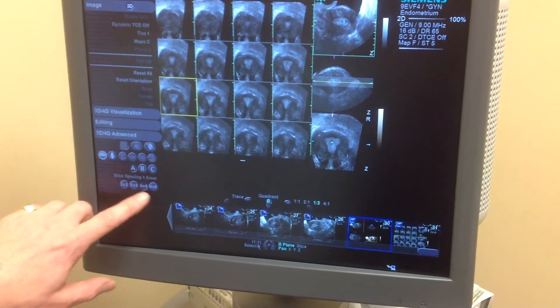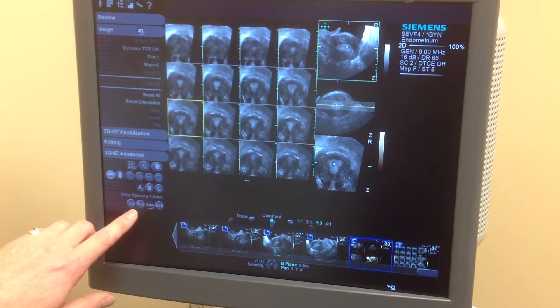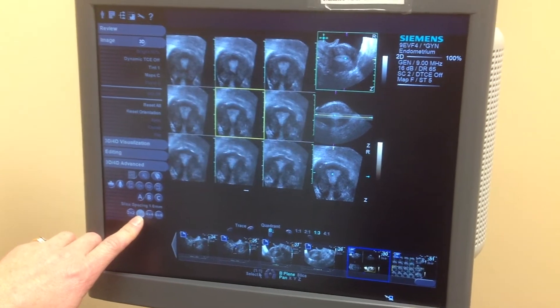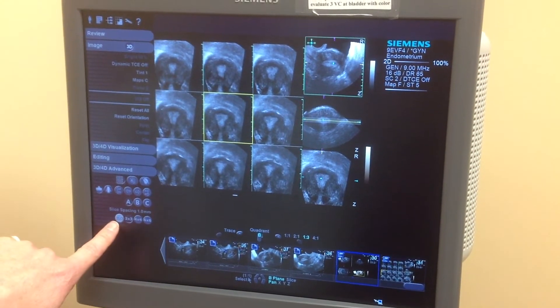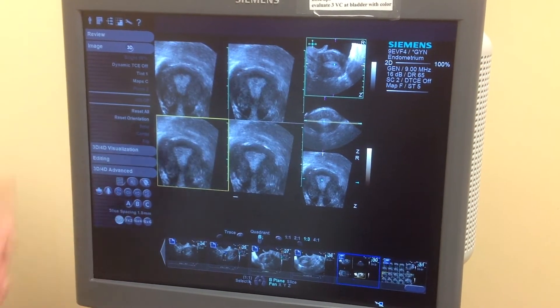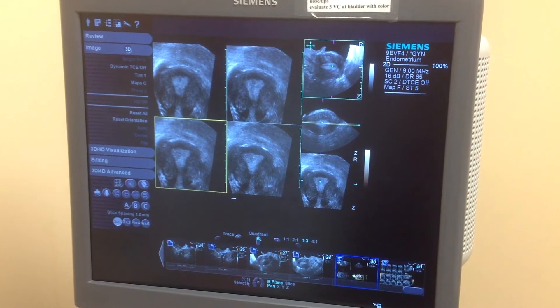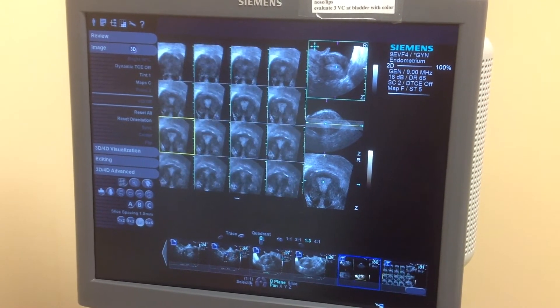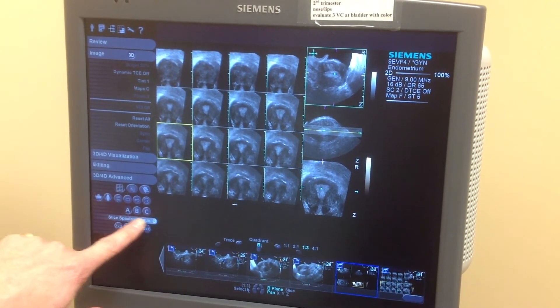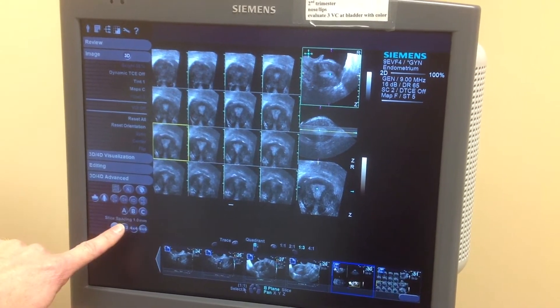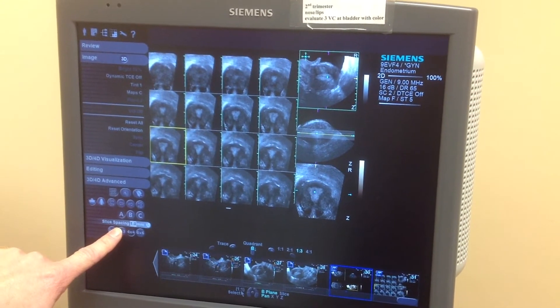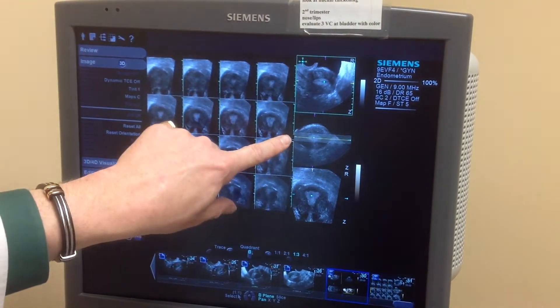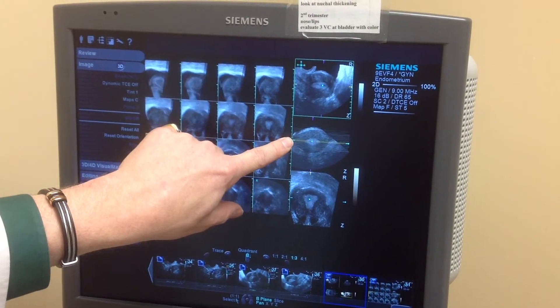If you want to make these bigger, you can change the format to a 3x3 to have bigger images, or 2x2 — it's all preference as to what you want to see. You can also change your slice spacing and dial it up or down in terms of the thickness of the slices that you're seeing.